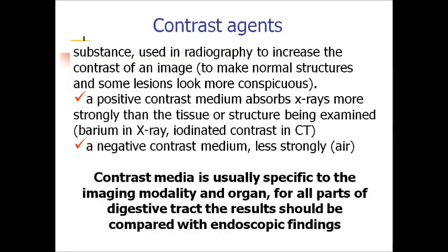Contrast agents are a very huge topic, but let's try to observe it briefly because it's very important in gastrointestinal studies. Contrast agents are substances used in radiography to increase the contrast of an image, to make normal structures and some lesions look more conspicuous. Contrast agents may be divided into positive and negative contrast medium.